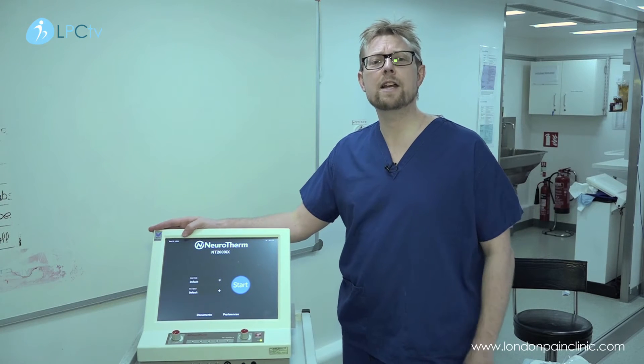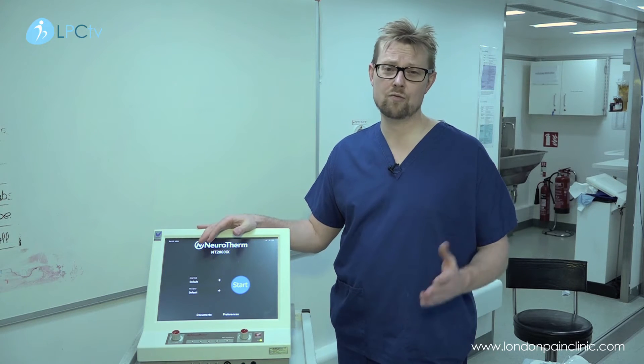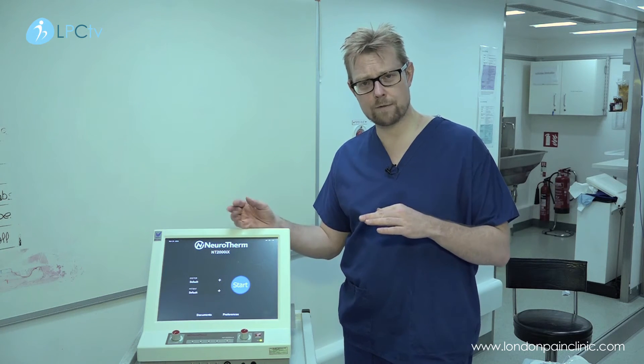This is a radio frequency machine. We use this for two major modalities: radio frequency denervation and pulsed radio frequency.